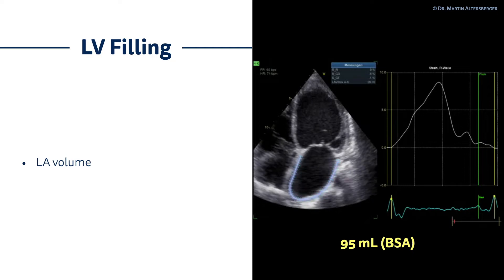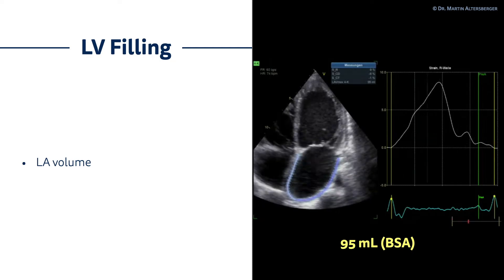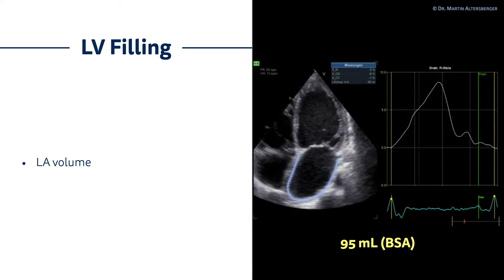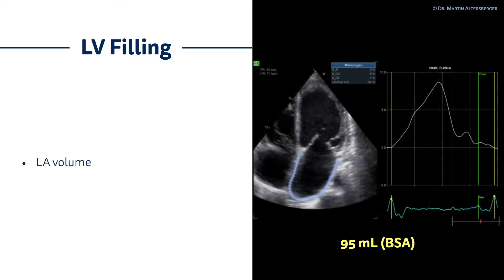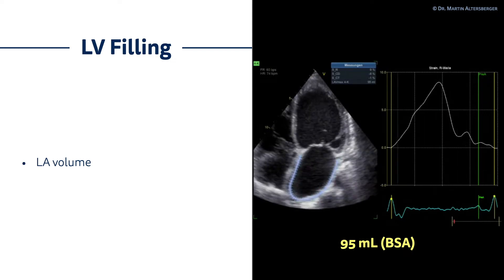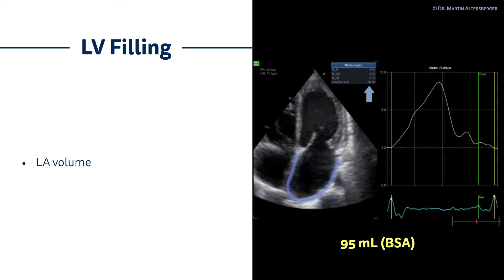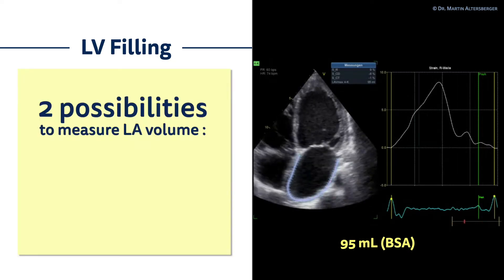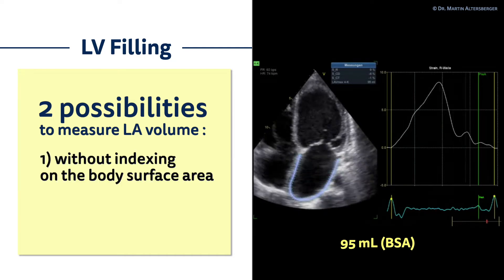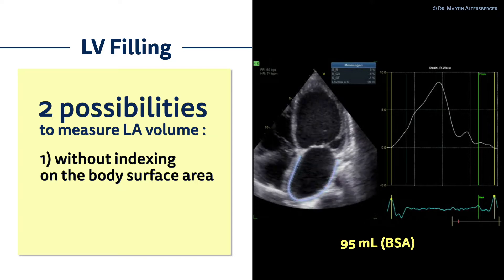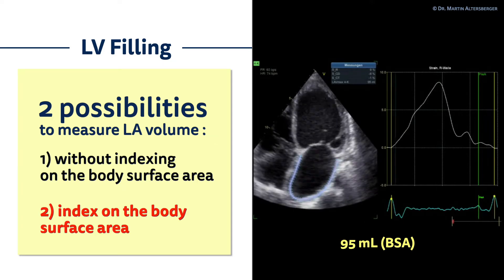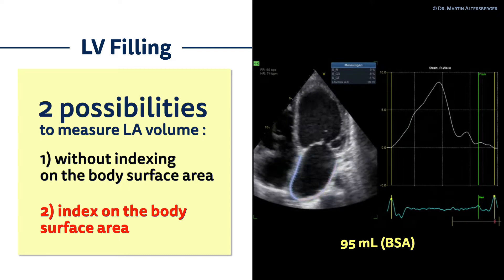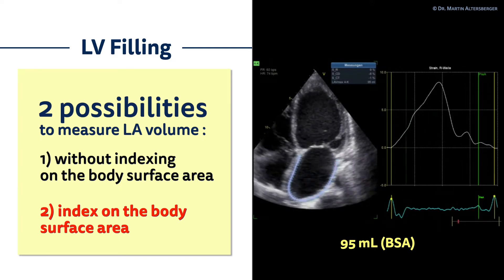The filling of the left ventricle is dependent on several factors. One of the factors is left atrial volume. On the right hand side you can see a loop where the left atrial volume is increased at 95 milliliters. You can measure it without indexing on the body surface area, or overall you should index it, in which case you will also calculate an increased volume. So left atrial volume in diastolic dysfunction and left ventricular filling is an important factor.